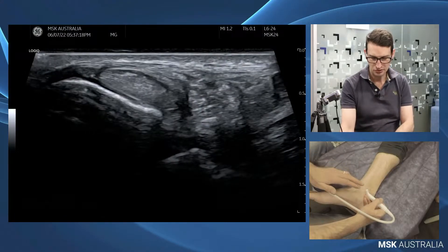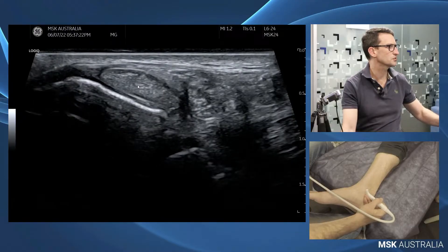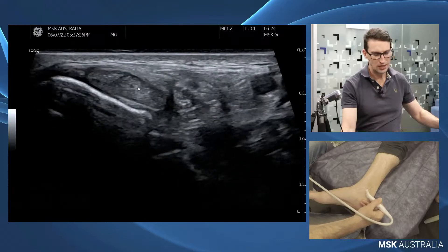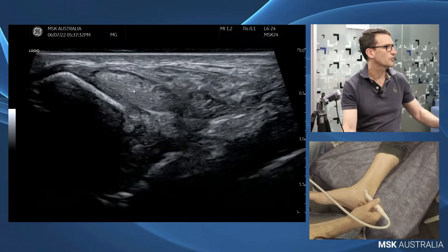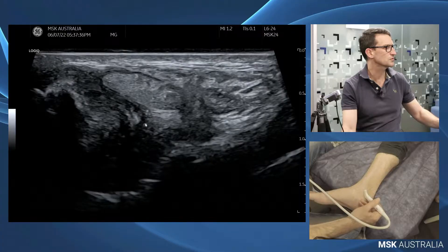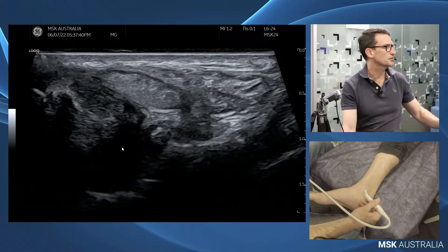The first thing I want to do when looking for the deltoid ligament is go to the back of the medial malleolus and pick up my tibialis posterior tendon. I want to follow that tendon around — it's a tendon that's turning, so I need to angle my probe as I come around. As we fall off the back of there, we come onto this little component of collagen, and this is our posterior deltoid ligament.